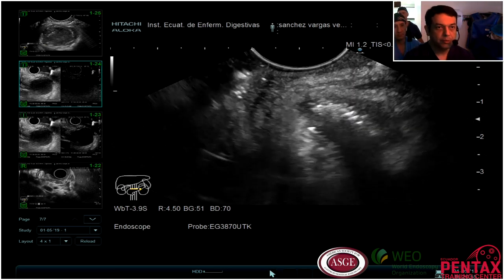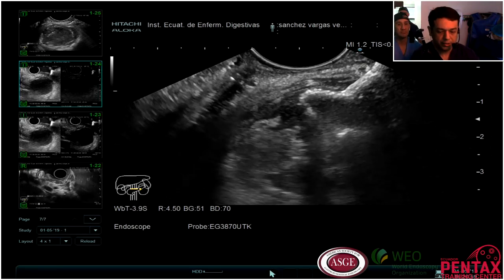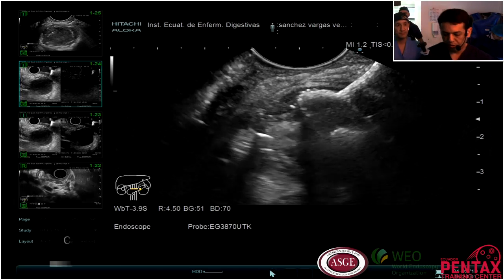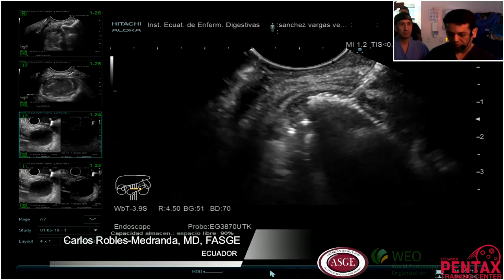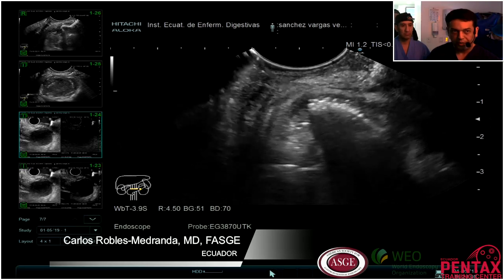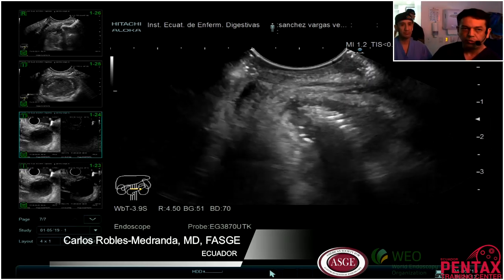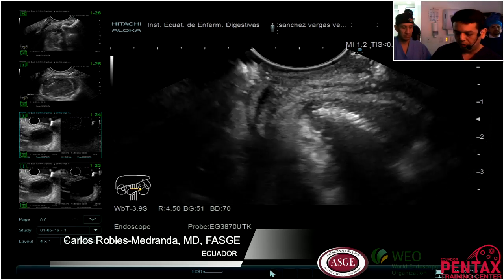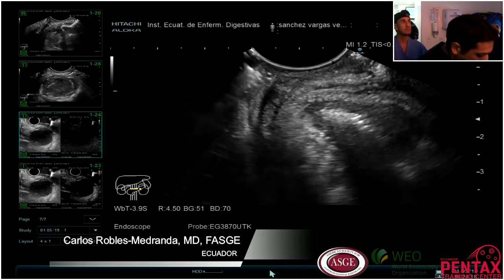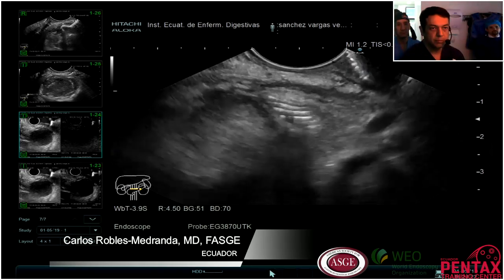I think we finish already. And how much time do we need to wait? I think in 48 hours, and this will be solved. So probably in 15 days, or less, 10 days, we can retire the hot axis. Perfect.